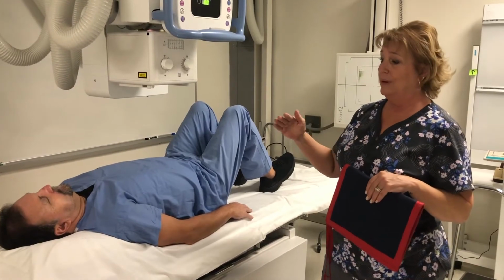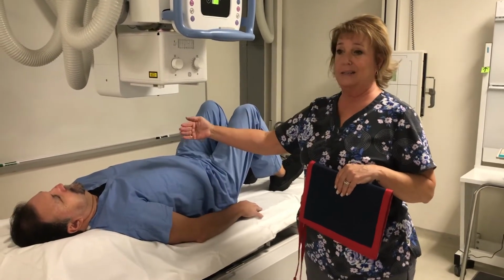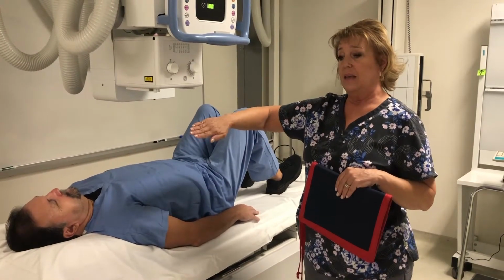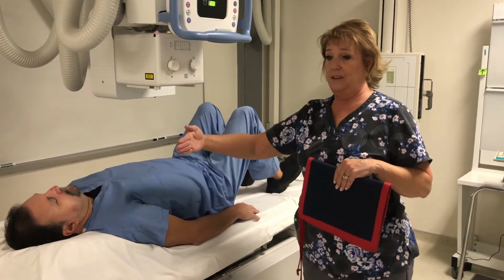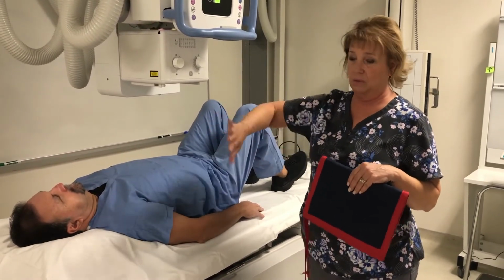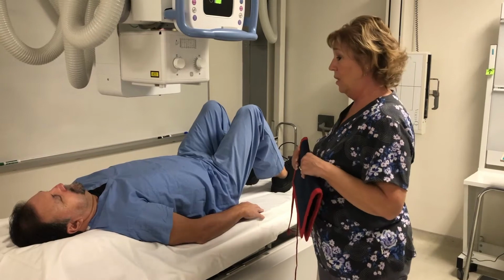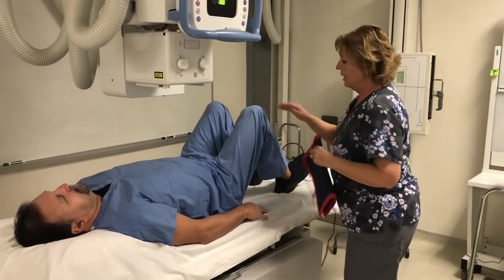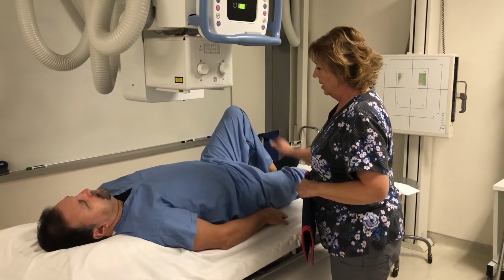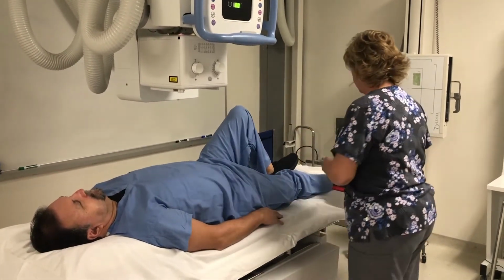Okay? Now, when you're doing a full 5-view L-spine, it includes 2 obliques. And because we're going to end up eventually on his left side, I'm going to do the RPO first, then the LPO, and then finish with the lateral. It's just a better sequence so that the patient's not rolling back and forth more than once. So I would like you to extend your right leg for me. I'm going to keep your left leg bent.